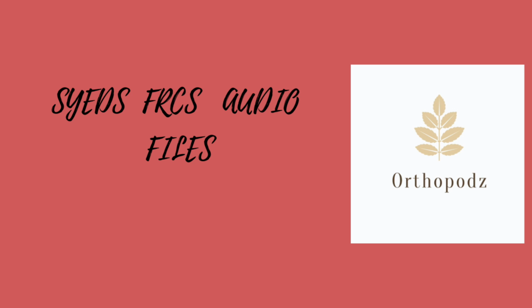Contraindications are pacemakers and defibrillators, cochlear implants and internal hearing aids, implanted nerve stimulators, metal objects in the eye, intracranial clips, and mechanical heart valves.